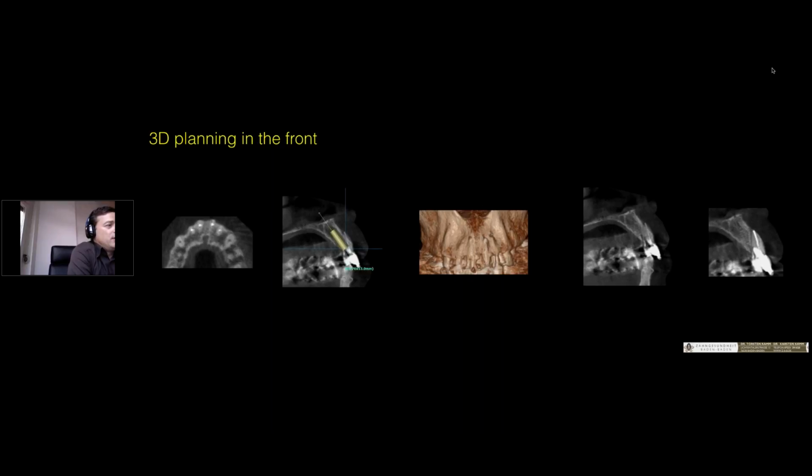This is the past. It is very good for getting very high stability, but it's very difficult to cover these implants with crowns. In the last 5 years, we changed this direction. You see, we want to have the same angle as the teeth had before. We also want to go a little bit more to the palatal side, but to get a little bit more bone.